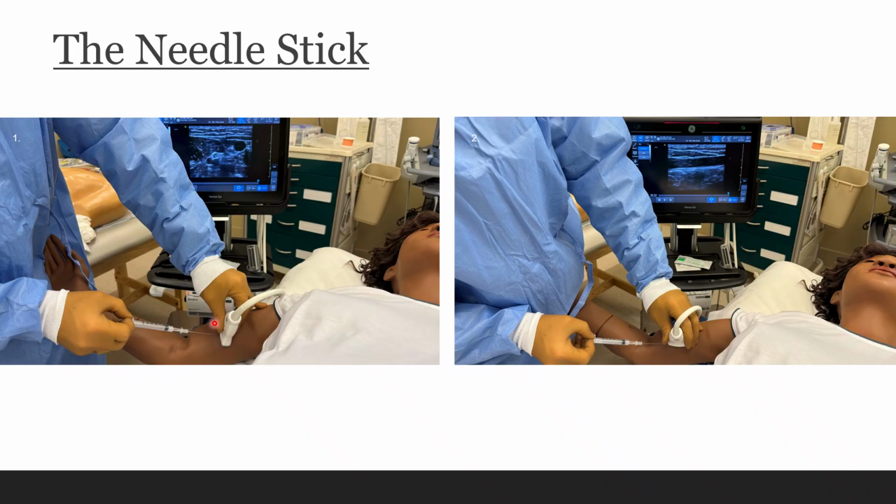You have your sterile probe cover over the ultrasound itself. And then you'd have this machine a little bit more in front of you. This is just so we could demonstrate everything at the same time. And you'd have the drape over the patient's arm. Some stretchers have the ability to possibly maneuver out so you can put their arm on it. I often actually grab a little bedside table and place it right at the same level as the patient's arm and have them extend it out, place it there, and then put the drape over it. So when you're kind of leaning into them, you're not contaminating your sterile gown.